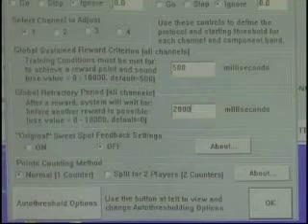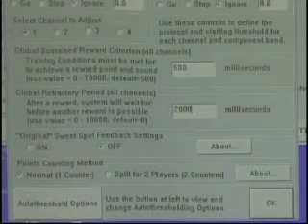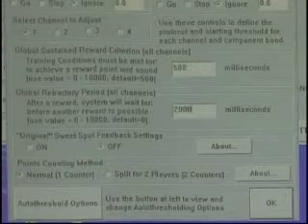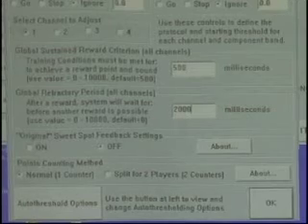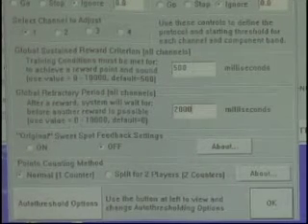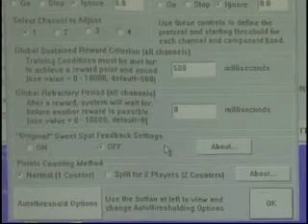Questions? So if it's on 0, are we going to get a string of discrete tones or a continuous tone? Still discrete tones. Ding, ding, ding. What happens is when you meet all criteria, it plays what's called a .wav file. So if that .wav file happens to be a hammer or a ding, it's going to play the file, and then it's going to play the file again, and again. It's not just going to go ding. It's going to continue: boom, boom, boom, boom, boom. Okay. Everybody like those sound effects? Good. Cool. All right. Any questions?